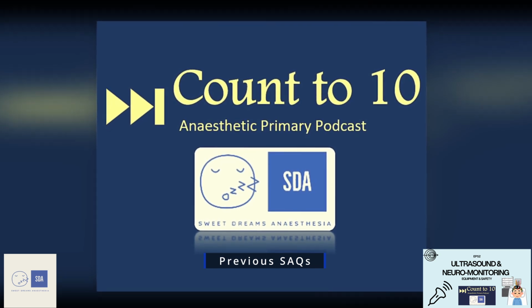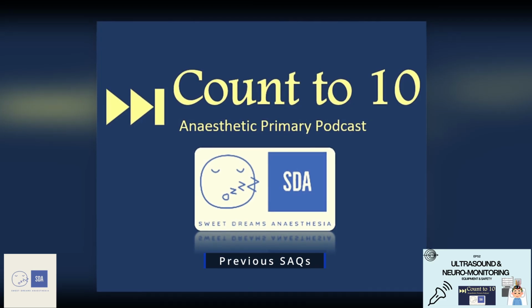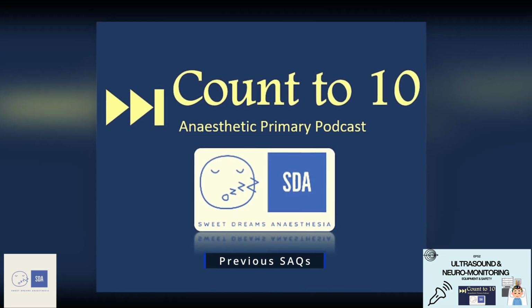And now we have the velocity and we have the area. So if we times the velocity by the area, we then have the stroke volume. And by timesing that by heart rate, we now get a cardiac output.